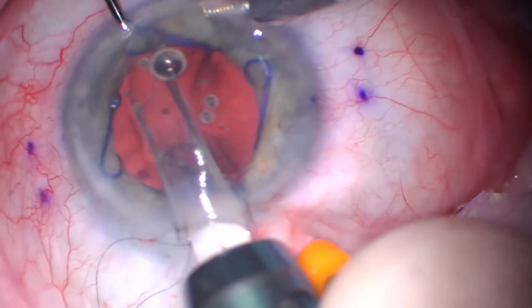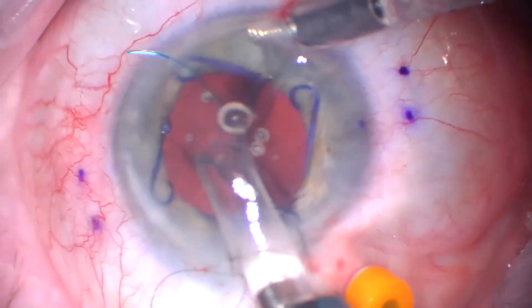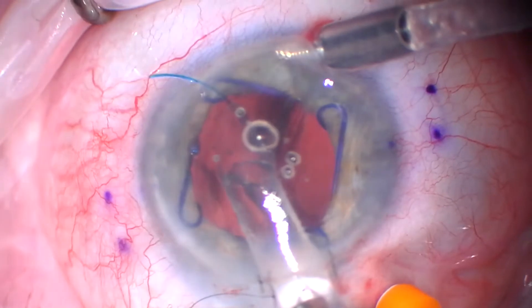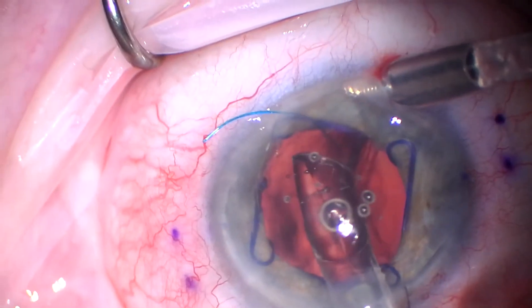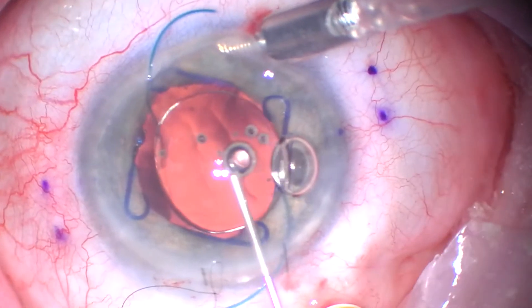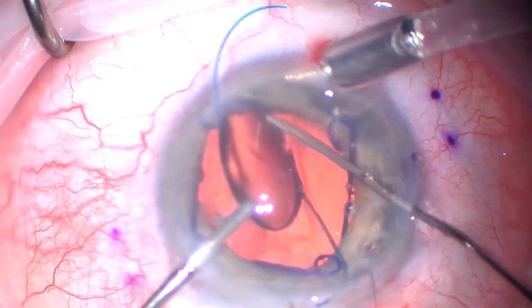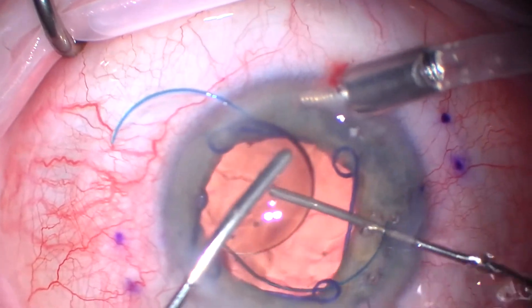This is Brian Kim's trailing haptic first technique where I'm externalizing this haptic. I'm so focused on telling my assistant how to rotate the handle that I forget to pronate my wrist. I mostly do one-piece lenses in typical cataract surgery and don't do a ton of these three-piece lenses. So here I forget to pronate my wrist and the IOL is going to unfold — it's going to try to go upside down. Now we have an upside-down IOL, which is not that big of a deal. With more Viscote, my left hand with a cyclodialysis spatula above the IOL and my right hand pushing with the Viscote cannula, we just flip it.